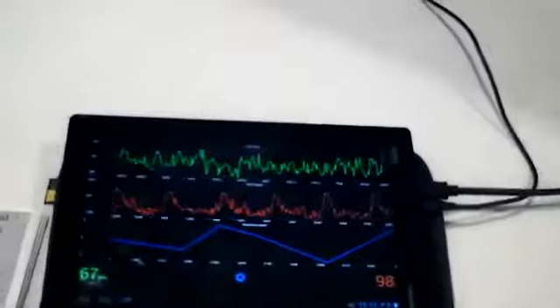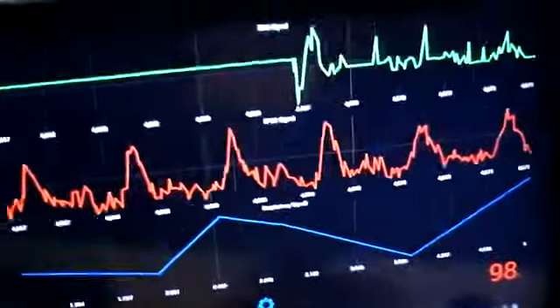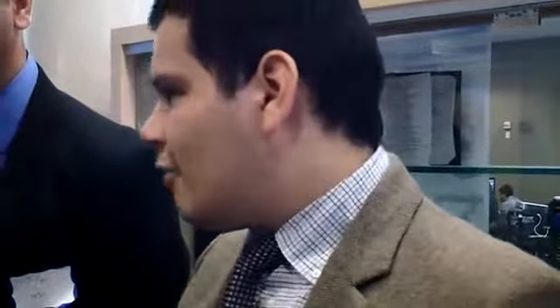Okay. Wow. And I think what's most cool about this is it connects up with digital devices. Well, one of the things that's great about that is its primary purpose originally was for remote monitoring, but even with a small device, it gives healthcare professionals the ability to have comprehensive data analysis locally as well. You don't have to use it at the hospital side at all. It can just be used as a standalone medical device. Okay.